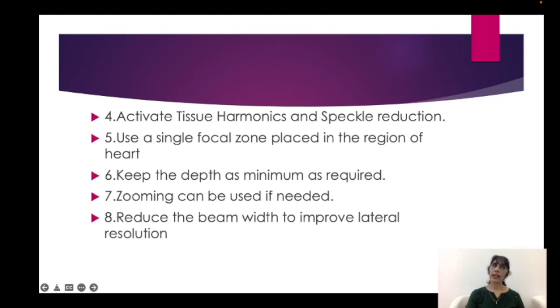Then yes, you can use zooming here, although zooming will reduce the resolution. But nowadays, most of the newer machines don't have this issue. So when you zoom the picture, normally we say the picture quality is going bad. But here sometimes you can use it when you want to see the valve movements more clearly, or you want to see the color flows more clearly, right? Then you may use it, but only when required.